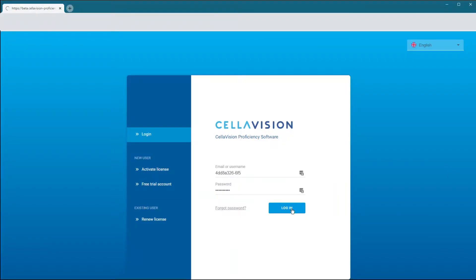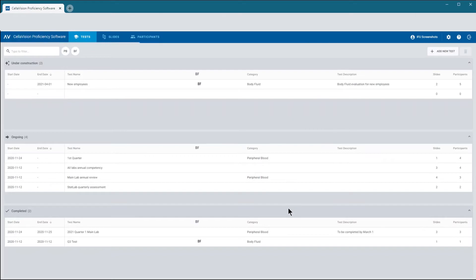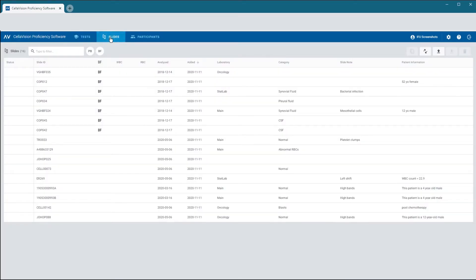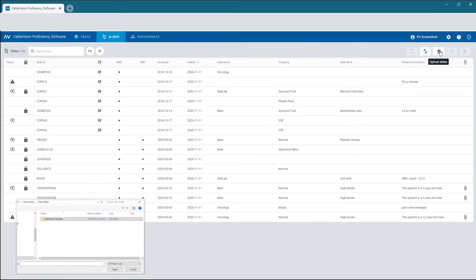Next, log in to your CellVision Proficiency software account. In the Slides tab, click Upload Slides and navigate to the location where you saved the files.